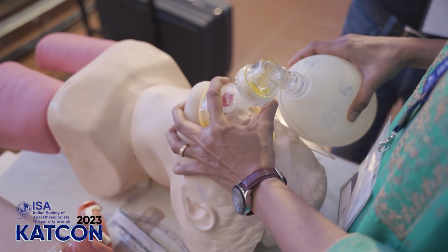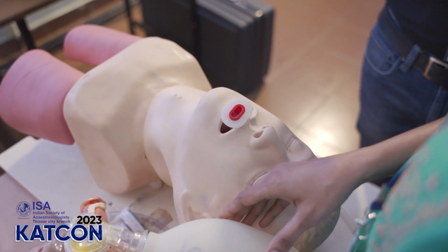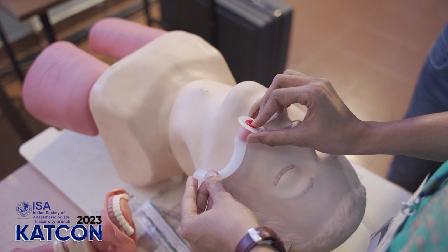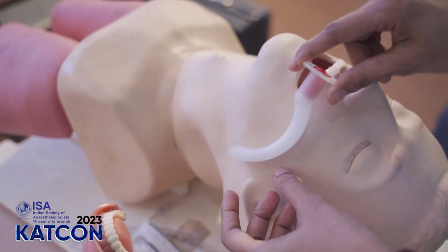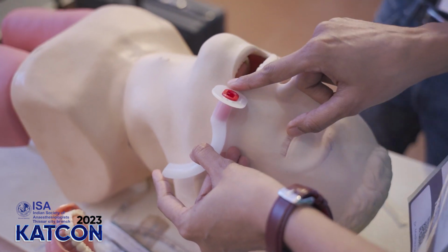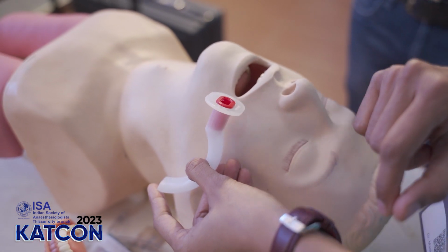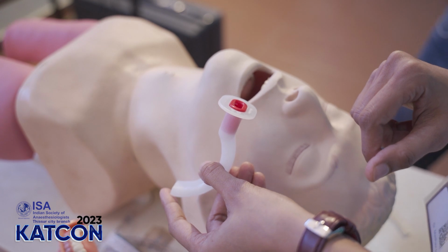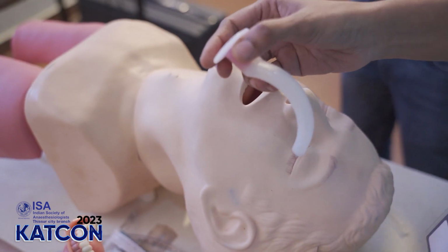This helps in ventilating a difficult mask ventilation patient. And to determine the length of the airway, you can use this technique. You measure from the angle of the mandible to the angle of the mouth. This is an easy way to measure the size of the airway. Depending on the size of the patient, for a smaller patient you can take smaller numbers, and for a bigger patient you can take higher numbers. This is in short about the oral airway.